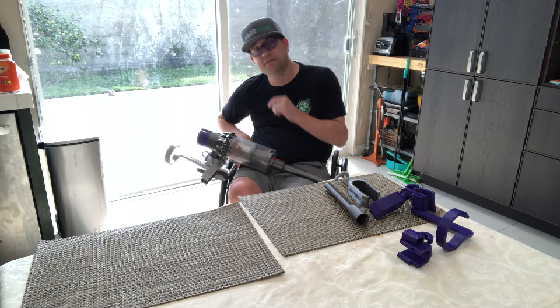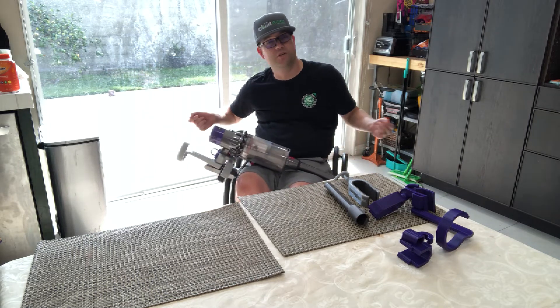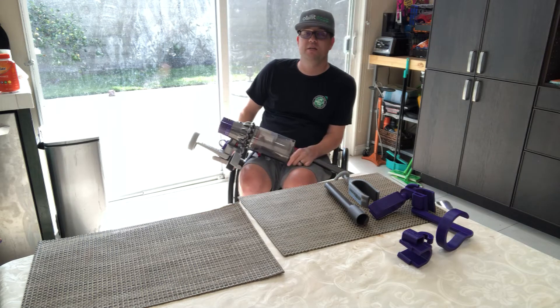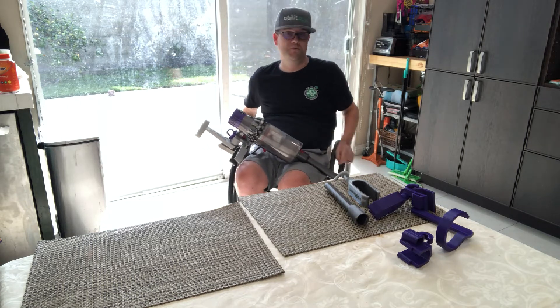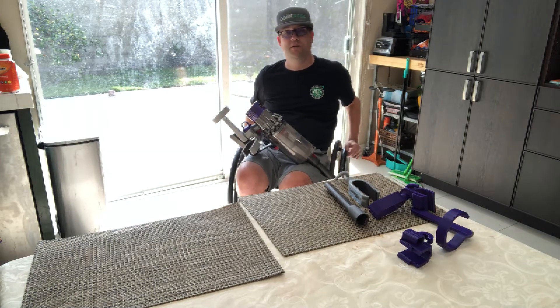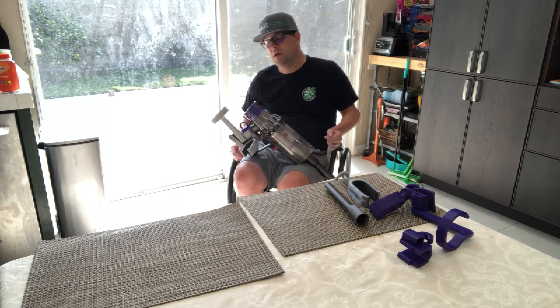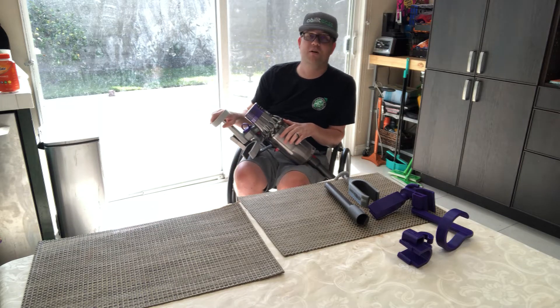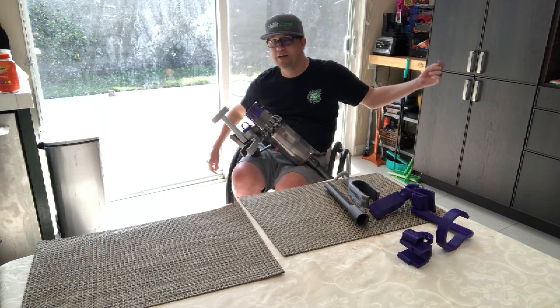I'm really happy with version 2.0 because now I can use the larger attachment and do the larger part of the house. Please leave your comments and questions below — I'm interested to hear your thoughts on version 1.0 and 2.0 and how this might work for you. For individuals with hand dexterity issues, this would be a great option for inclusive design. Dyson doesn't have to redesign their whole product — we just snap on a piece like this.